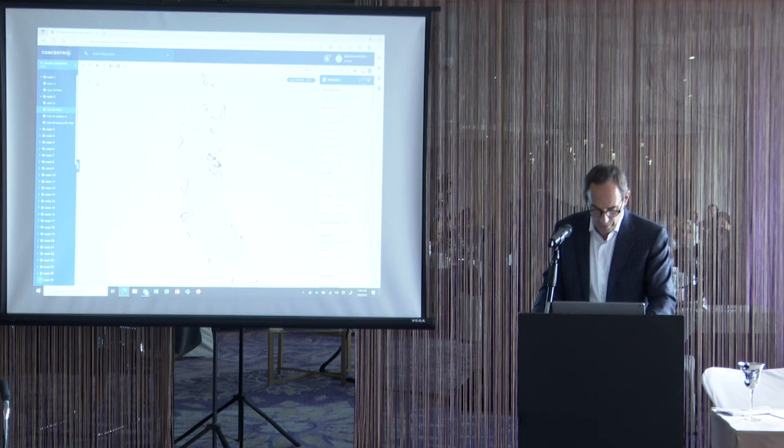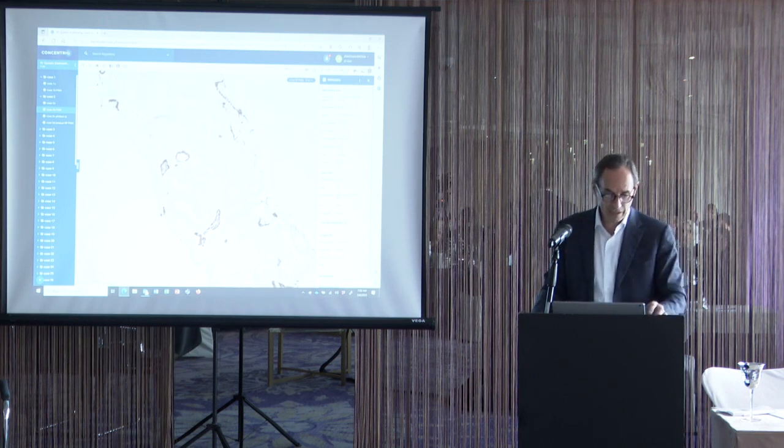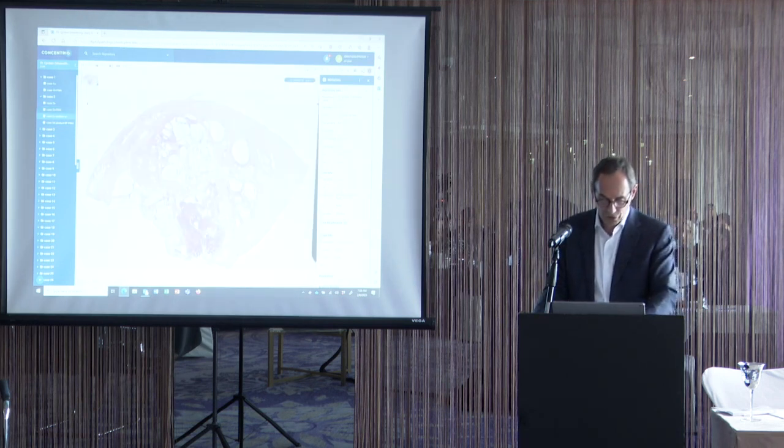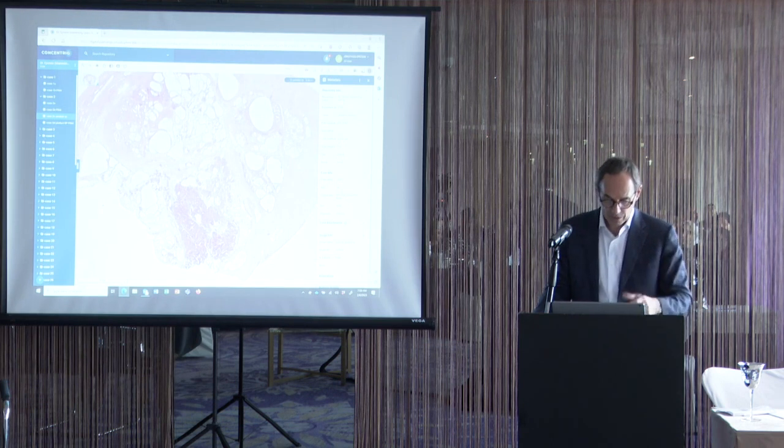And when you do the basal cell stains, you can see all the glands in the middle that look more like PIN are entirely negative. And if we look at some of these glands along the edge, they're also negative, these big cystically dilated spaces. All along here, this whole big strip of epithelium is negative. So this is PIN-like ductal cancer, and I would grade it as a 3 + 3 = 6.